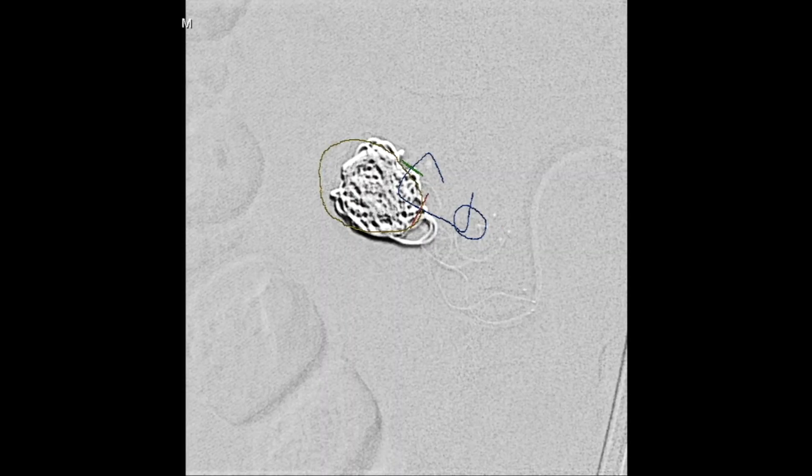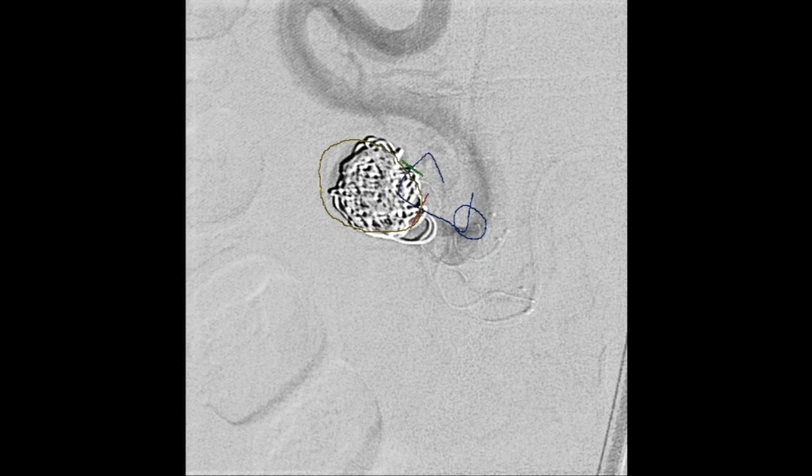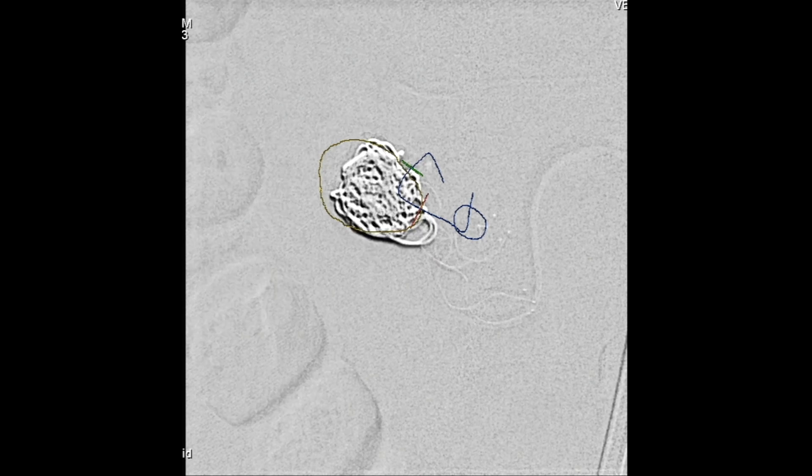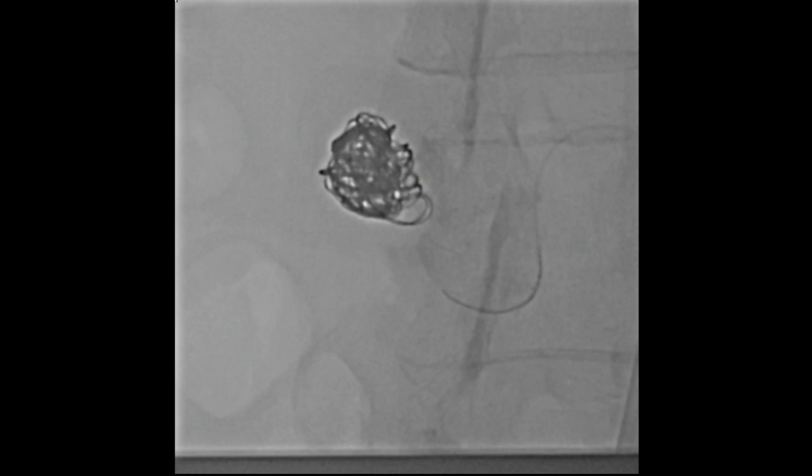Now you can see the stent has been deployed and we've retained flow through the anterior division — we're injecting directly into that anterior division and you can see we've still got flow there, which is excellent. One more coil was then placed just to pack it a little bit more. It's always the last coil that gets you in trouble — this one trailed alongside the stent a little bit, but not badly.